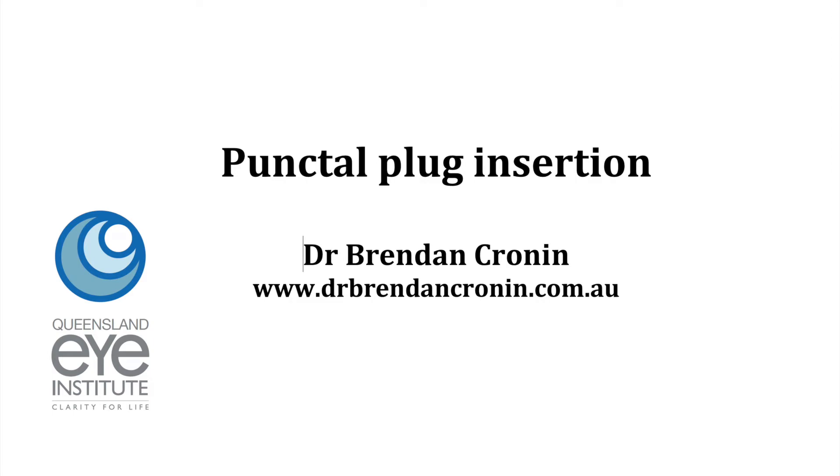Hi, this is Brendan Cronin. A lot of optometrists have requested a wet lab on punctal plug insertion. That's difficult to do — we can't really do it on each other and there's no real models for it. So I've done a quick video here explaining the technique. It really should make it very easy for you to learn to insert punctal plugs.